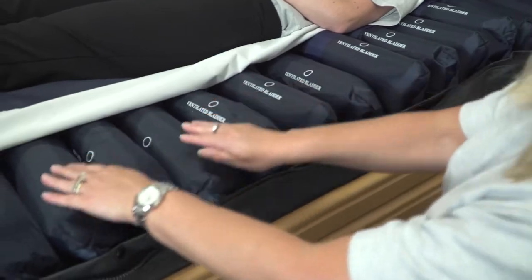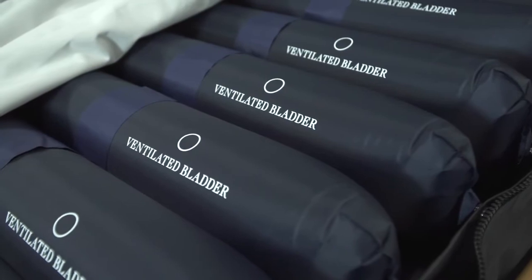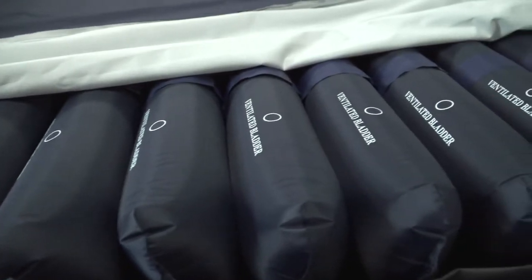The 200mm high cells cyclically inflate and deflate in an alternating pattern, providing direct pressure relief throughout the dynamic process. The Ayrshire can be used for patients up to a weight of 180kg. The mattress dimensions are 200x88x20cm and the product is easy to move or transfer, weighing under 7kg.